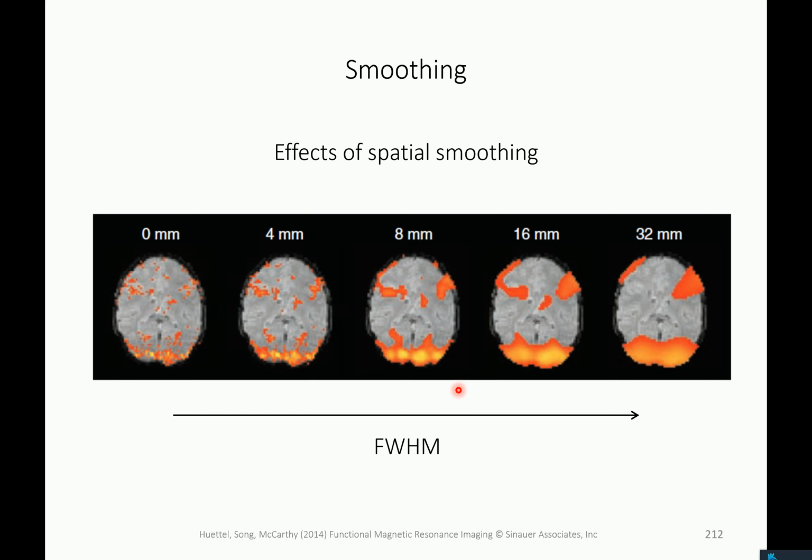So this width which you take is like a standard deviation of a certain kind of Gaussian. It's just the width of the filter. It's just a parameter, and the standard deviation of the Gaussian you can convert, based on this little formula there with the ln, into the full width half maximum. If you want a proof for that, it's actually in the paper on random field theory.